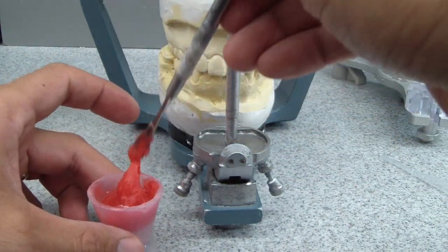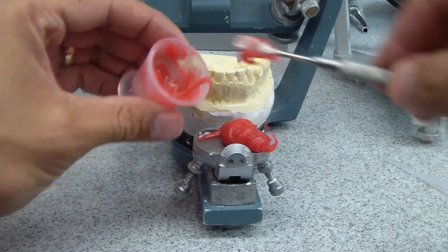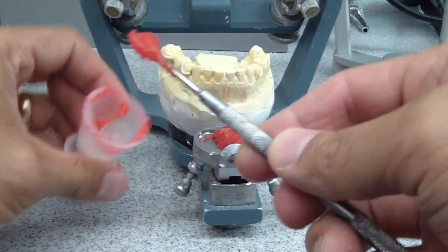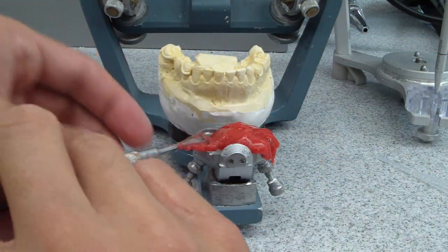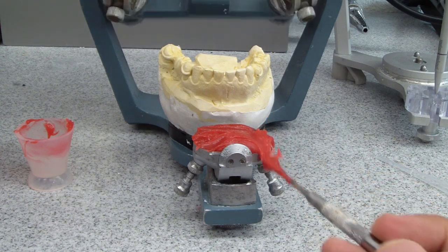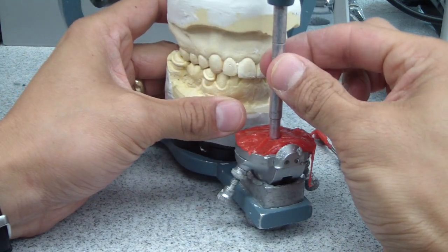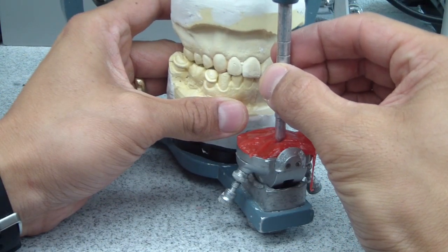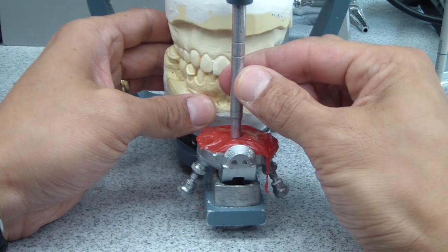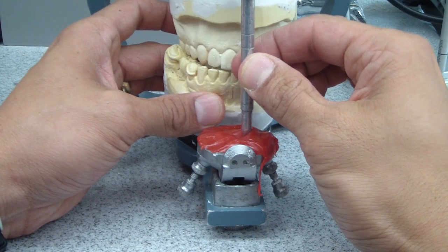We're mixing up the acrylic and placing it on the guide table. The guidance is on my canine-guided left excursive and right excursive. This is actually a lab scenario. Oh, this is starting to set now.